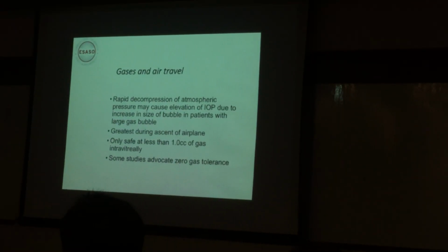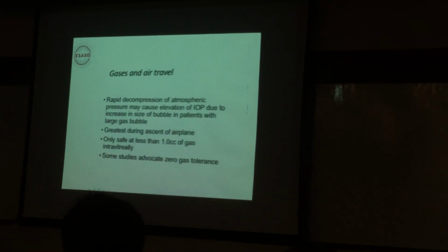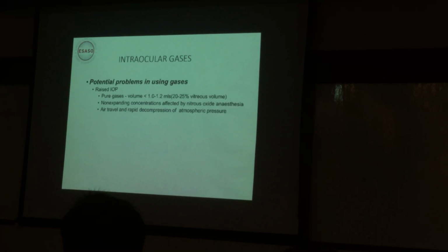It was mentioned earlier about the air travel. So rapid decompression of the atmospheric pressure may cause a dramatic elevation of the IOP due to an increase in the size of the bubble in patients with a moderately large bubble. Okay? And this happens usually during the ascent of the aeroplane, and then it stays in that state until the chamber is decompressed again. Although some people feel that less than 1 cc of gas is safe for air travel, there are some other studies that advocate zero gas tolerance. That means you have to wait for the entire bubble to dissolve before you allow the patients.